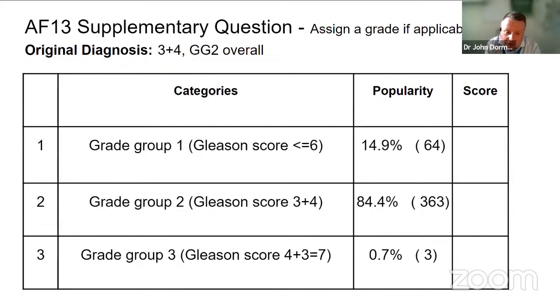So I would suggest that grade groups 1 and 2 are correct, but grade group 3 is probably the outlier clinically, and we had a discussion about how to score Gleason grading before on the merits of the case, but also thinking about the clinical management of the patient. So 1 and 2 are probably okay to be correct, and grade group 3, but we'll see what you say.